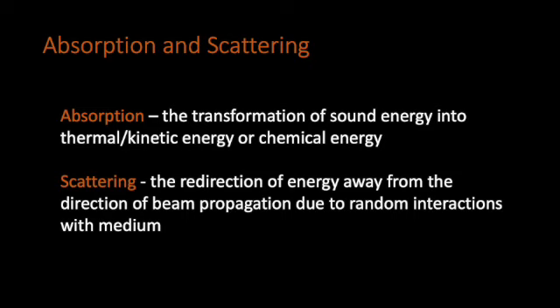And so some sand gets pushed upwards and lifted. Some sand gets pushed down into the ground and results in friction. Some sand has little waves passing between it. The same thing happens with ultrasound as it interacts with the small particles and cells inside the human body. Tiny little wavelets are pushed off in every single different direction, and that scatters the energy out until it can eventually be absorbed or otherwise lost.